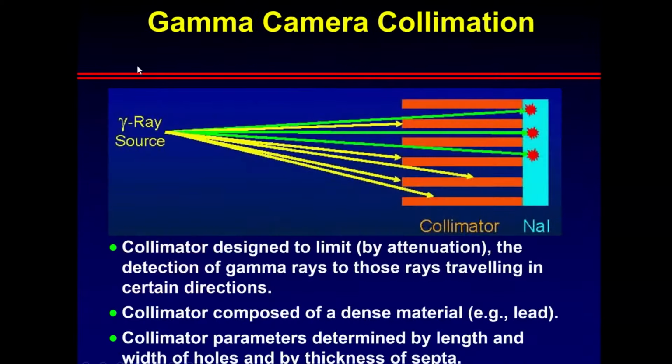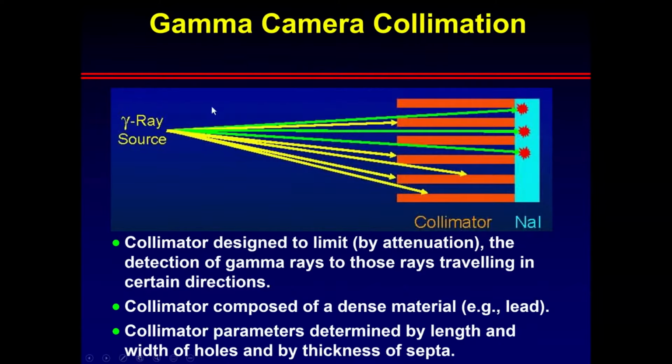There are many ways in which we want to be able to collect the proper photons. And so in nuclear cardiology, we use these things called lead collimators. And lead collimators direct which photons we actually are going to accept and which photons we are not going to accept. So let's take either our heart source or our liver source.